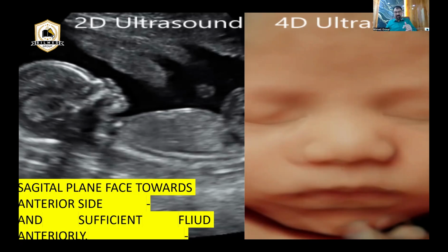Now, what is a good 2D ultrasound for a 4D? Because 4D is nothing but a, I should have a good 2D ultrasound slice. If my slice is not perfect, never ever I will be able to see the fetal face. Now, what is a good slice to get the fetal face, for example? Sagittal section.